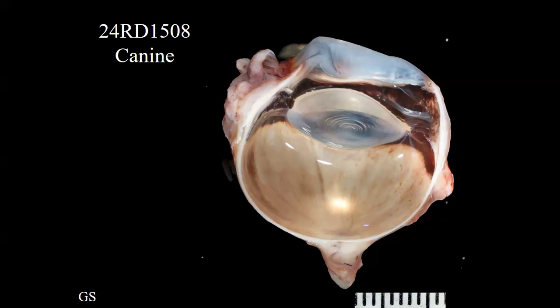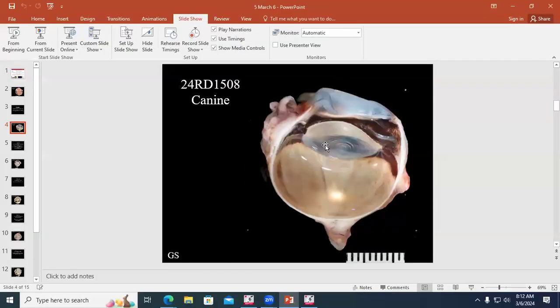Before you move, show the ciliary processes you were seeing through. Here, see them next to the, you want to show? Right here, kind of next to the lens. Yeah, right there. So it was really cool. They look like little black fingers. It was kind of cool. I've never experienced that before. Anyway, all right. So let's go check out our slide.